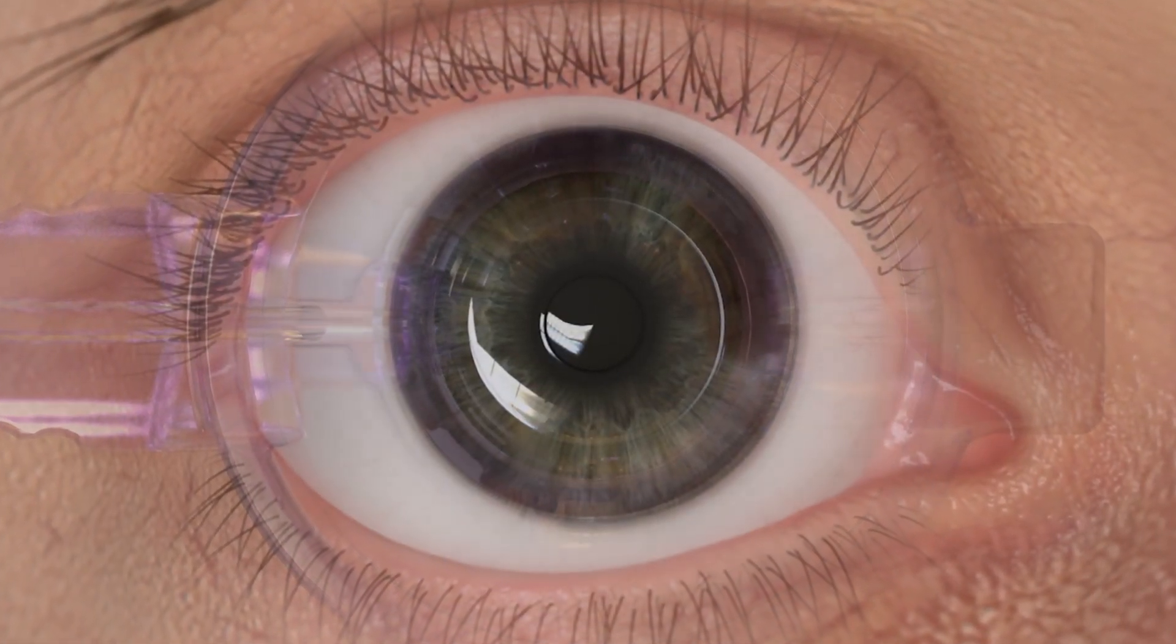The flap is created by first forming a tunnel to avoid an opaque bubble layer (OBL). The tunnel provides a path for the release of gas and water generated in the flap creation process.